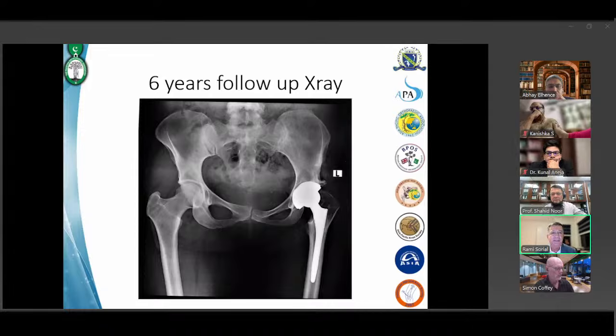I mean, she was dysplastic. She's been 50 years contracted, but nevertheless, it looks like offset's not quite there. I'd be concerned about impingement between the trochanter and the ilium in abduction and maybe in extension. So they're just things going through my mind. But again, it's just based on that one film. But you've got a good outcome for the patient.